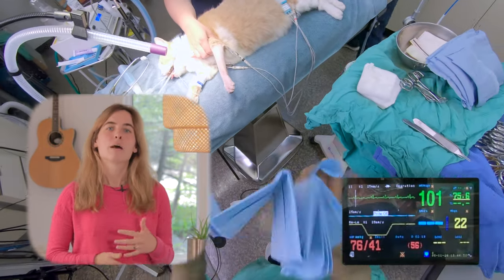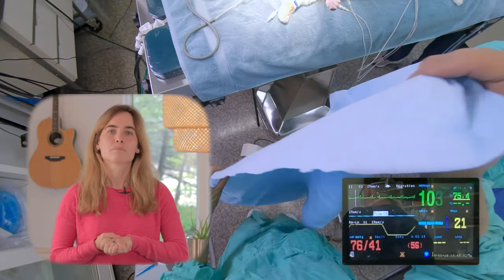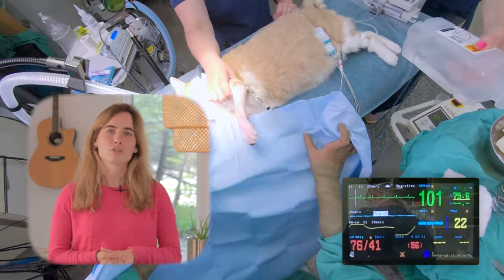And I'd like for you to have that same perspective. So to get there, I'm going to be incrementally introducing the different monitoring equipment on the screen. To start with, I'm going to introduce you to the Cardell.